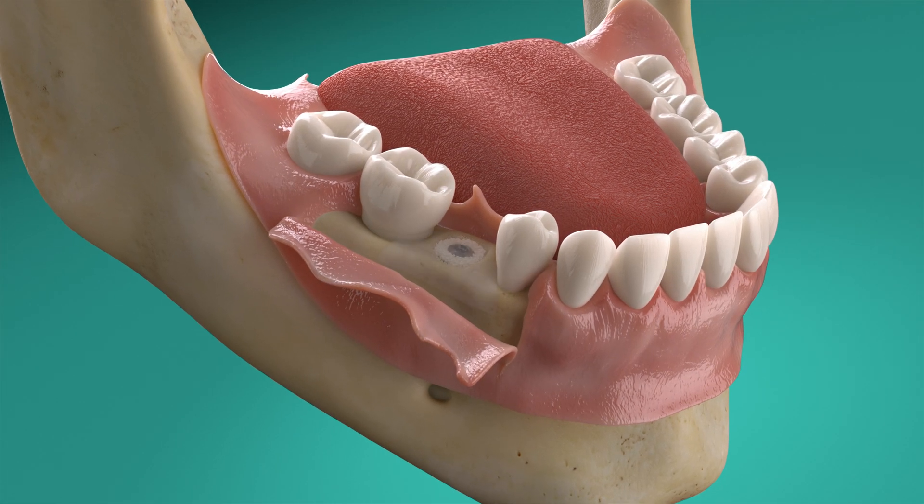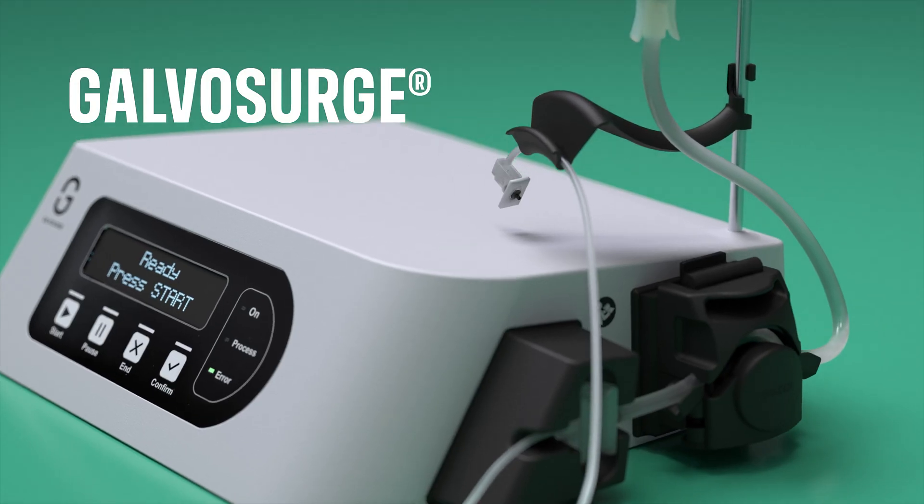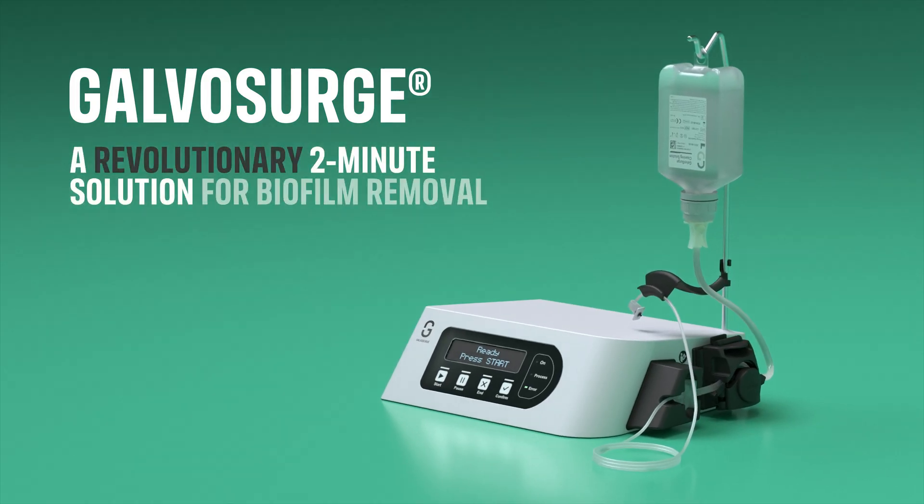Perform guided bone regeneration if required, and proceed with flap closure. Galvosurge: a revolutionary two-minute solution for biofilm removal.